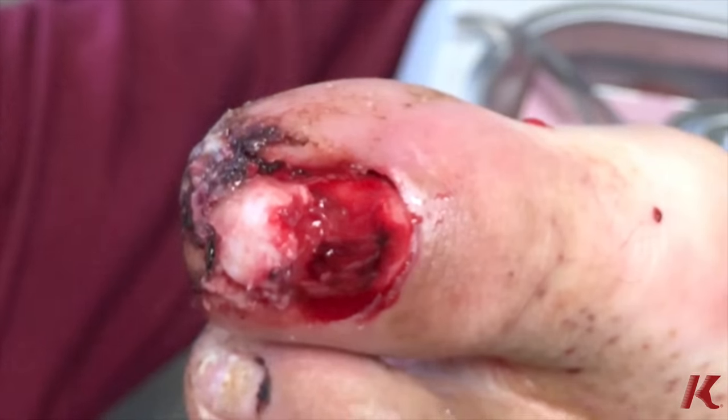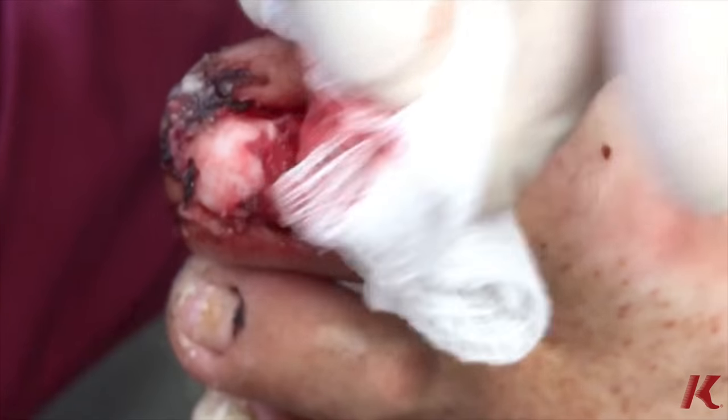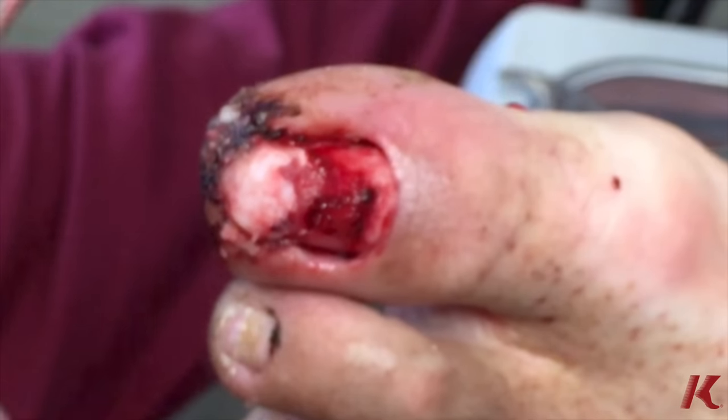So the nail comes off, and now we're just going to inspect the nail bed for any laceration. It looks fairly clean, no other signs of infection.